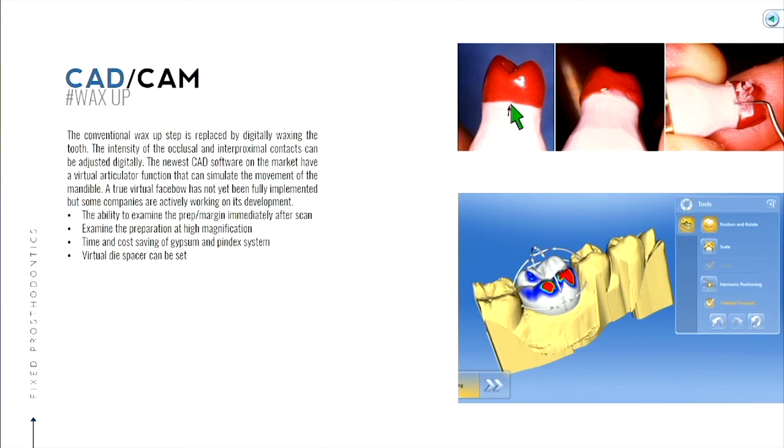But there's not a great way right now to getting that face bow measurement. So remember, the face bow measurement orients your maxillary cast in accordance to that hinge axis. So the way they do it in this software is they just arbitrarily put that maxillary cast really just in the middle of the articulator. Okay? So it's an arbitrary face bow position, whereas in your analog method, you can make a customized measurement there using our face bow record.